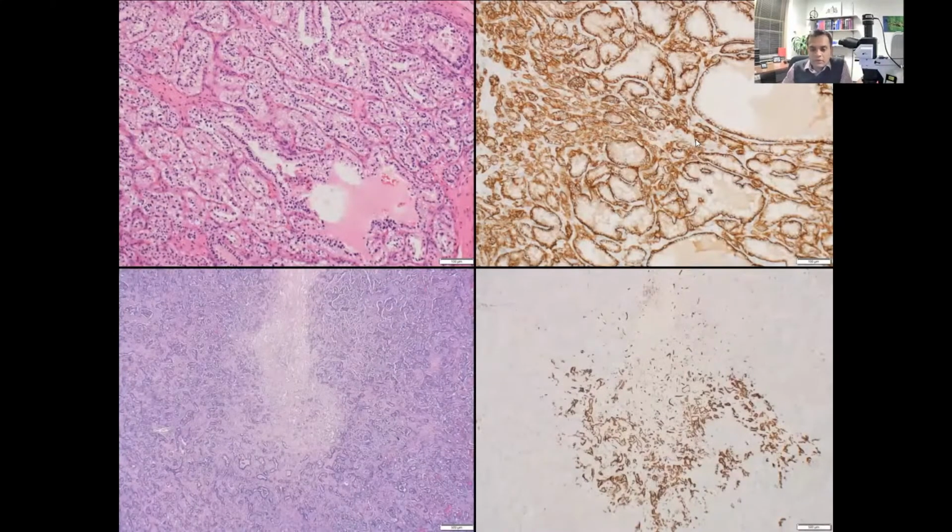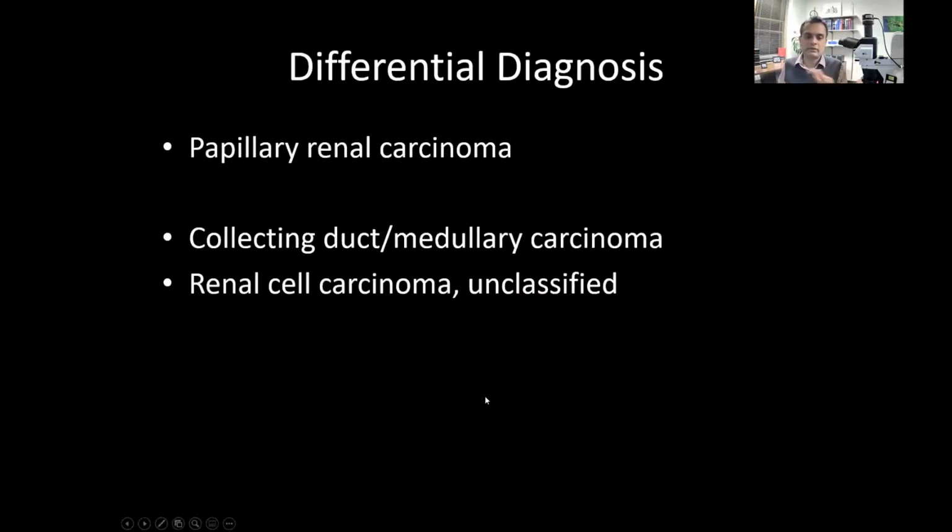In this tumor, if you go back and look carefully, CA9 is only positive in a patchy fashion, right? And that positivity is around the area of necrosis that we see over here. And CA9 being a marker of hypoxia as well is going to be positive in areas of any tumor that show hypoxic changes, right? So this is not surprising, and this pattern of staining where the rest of the tumor is negative rules out both these entities. So the clear cell renal cell carcinoma is also out because this also should be diffusely strongly positive for CA9.